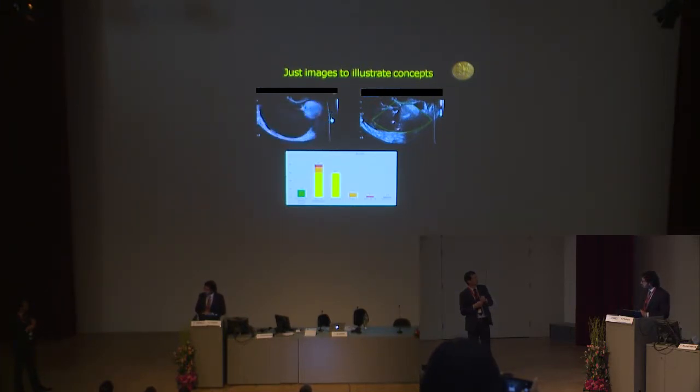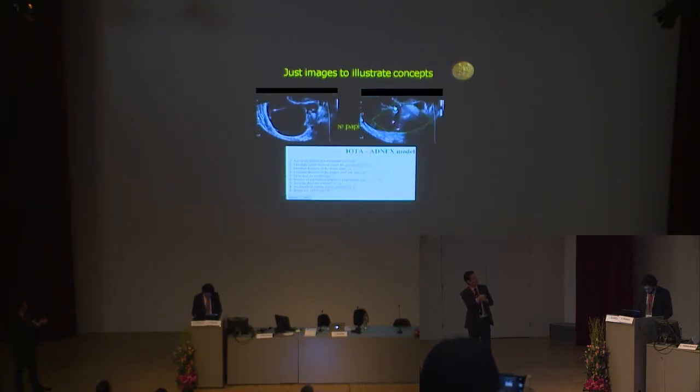There's clearly shadows to my eye, and there's also some kind of a fluid level. Fluid ascites, do you mean? Well, a fluid level. In this nodular structure, it seems that there's a fluid level. If you see the image on the right, it seems that there's a fluid level which is horizontal, because you hold your probe like this, so it's almost horizontal.